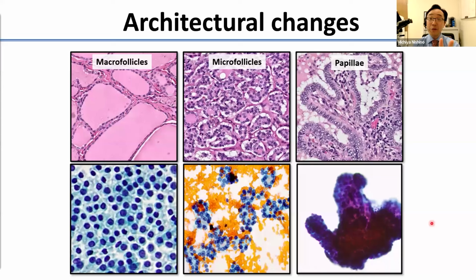The second main tool that we examine in thyroid FNAs is architecture. Histologically, normal thyroid follicles and macrofollicular lesions have these abundant colloid-filled sacs that are lined by a sheet of follicular cells that are pretty evenly spaced from one another. And as these follicular cells proliferate, as they do in neoplasia, they can do so in a couple of ways.